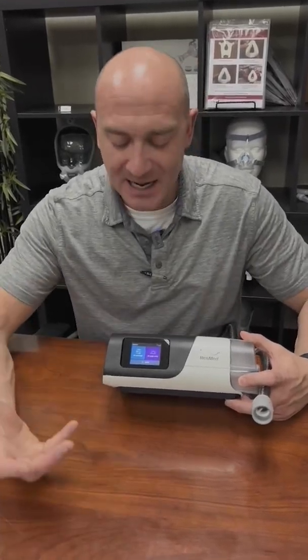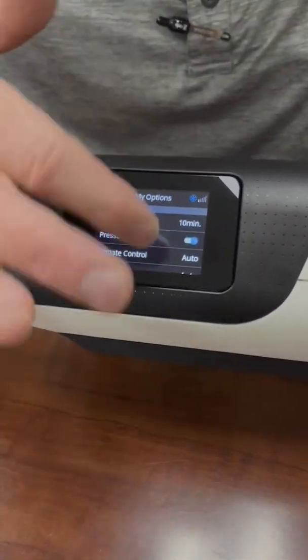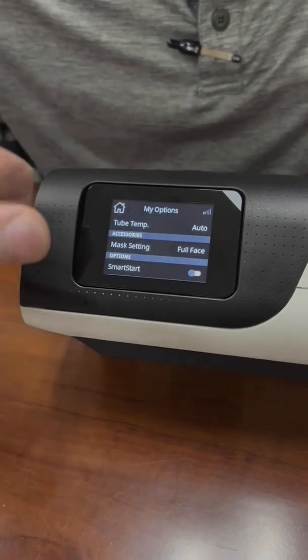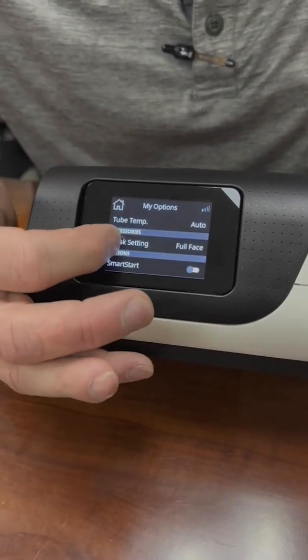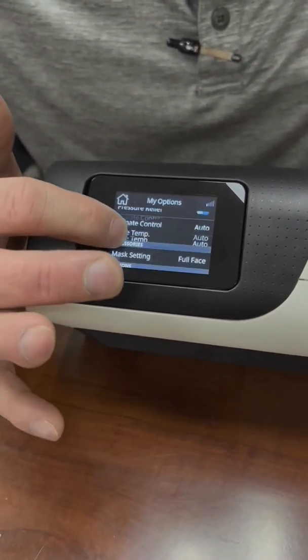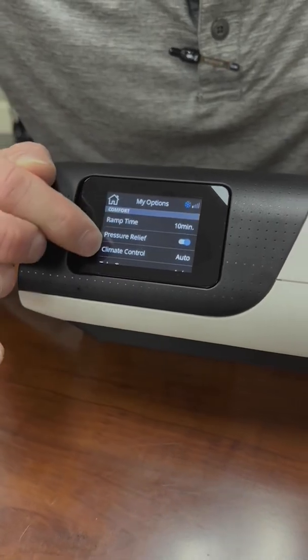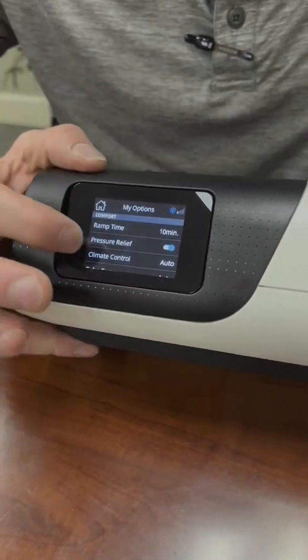So in the AirSense 11, if you go into the My Options menu, and if you see the menus, you can kind of see where this is, you're going to have an option to go over. You'll notice on here there's climate control, and sometimes you have to slide it up and down.